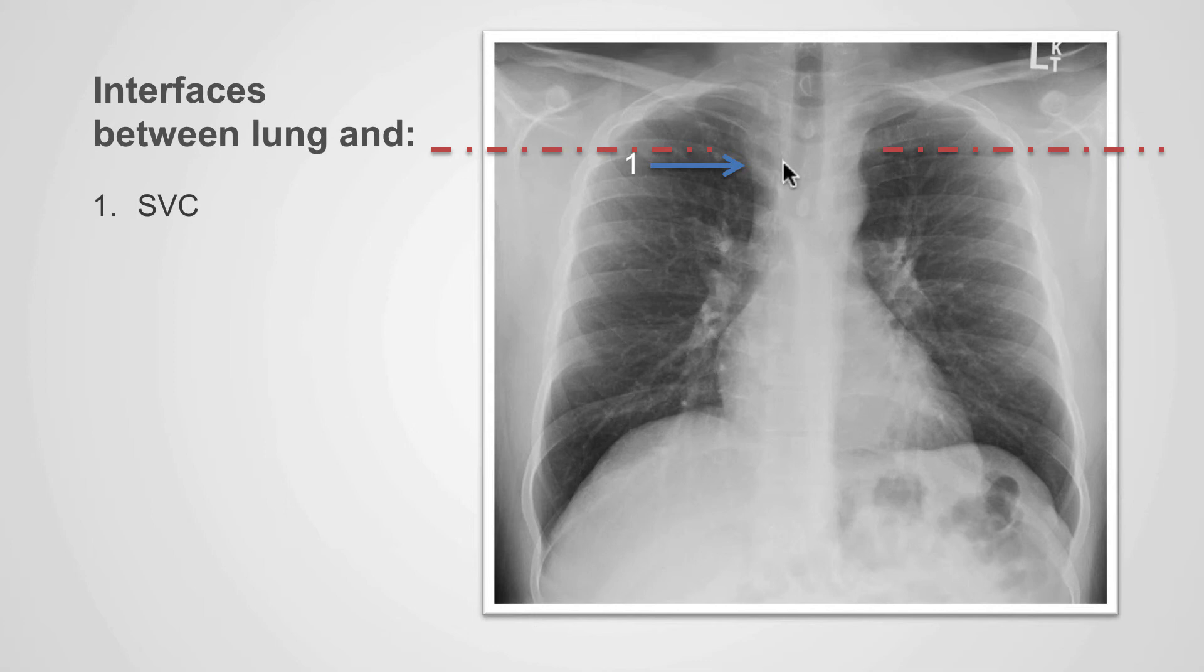We can see another interface at this level. Can you identify what that is caused by? That is caused by the tissues in the right paratracheal region. We can identify this rectangular structure in this region, which we've already learned is caused by the trachea.